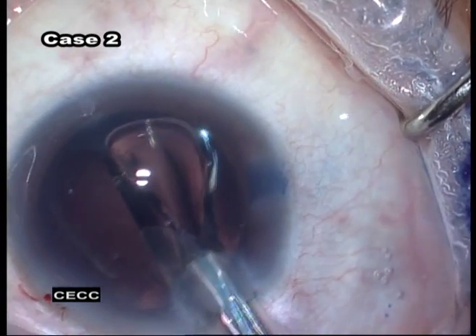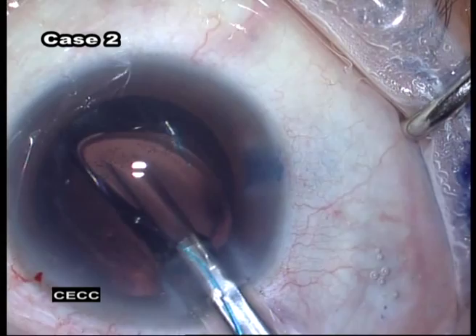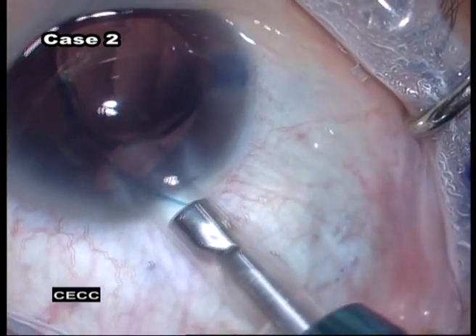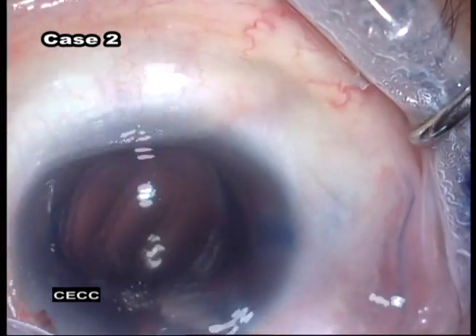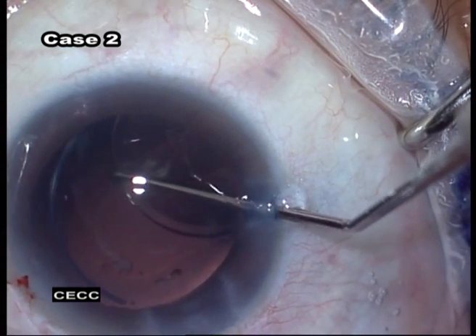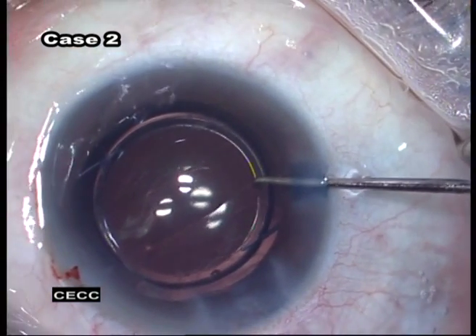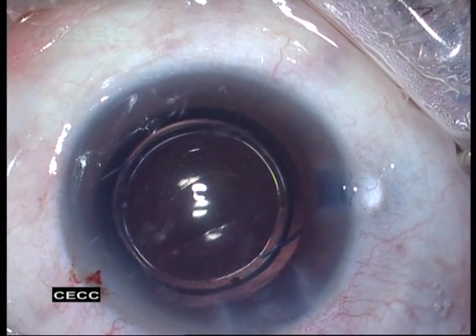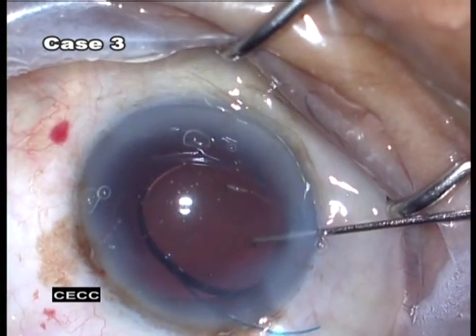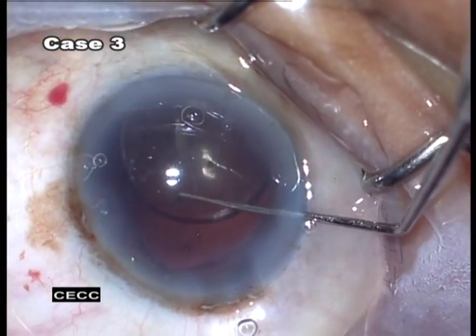At times, the trailing loop escapes into the anterior chamber and it can then be dialed into the back. Alternatively, withdraw the injector from the eye and place the trailing haptic into the bag using your usual method. At the end of the case, we have a very well-centered IOL in the capsular bag.